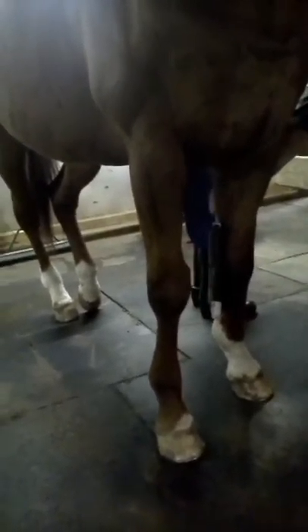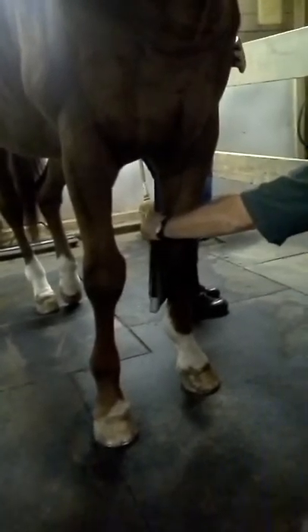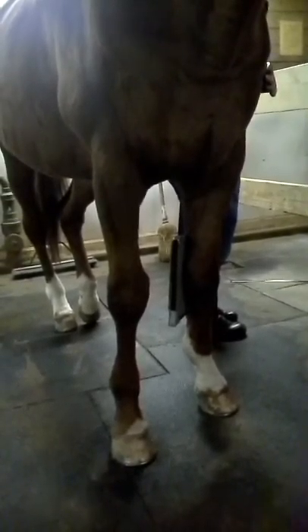You always want to have it perfectly parallel. If you get a little bit tilted, you have to correct it. Once you get the hang of it, you'll understand. That's a perfect oblique lateral.